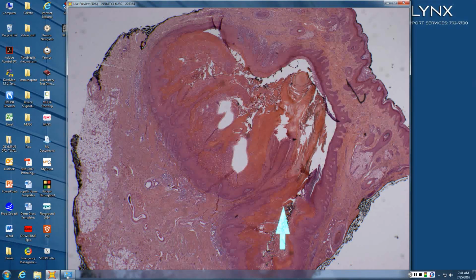So in a pilar cyst, the keratin is uniform, dense, and red. In an epidermoid cyst, it's lamellar, like shredded wheat. In this case, it's neither. It's compact, but it looks like someone's taken a tiny little cookie cutter and punched out tiny little white holes all through it. Pilomatricoma?